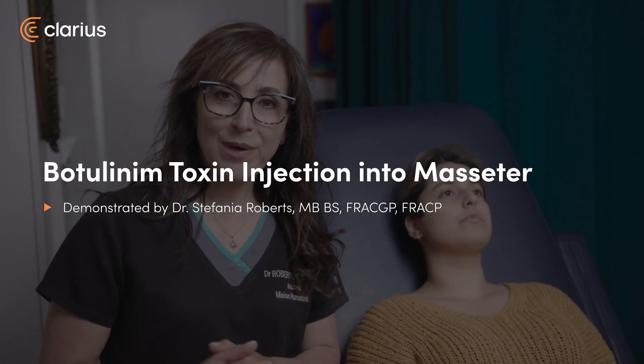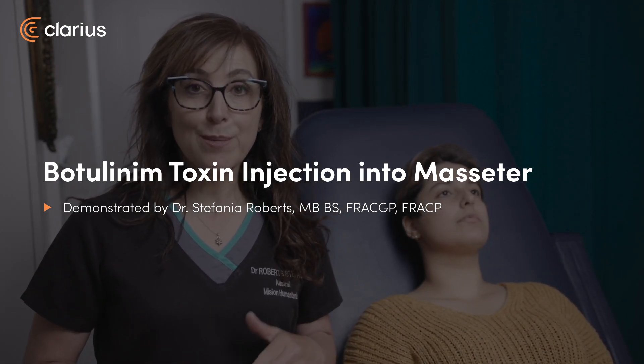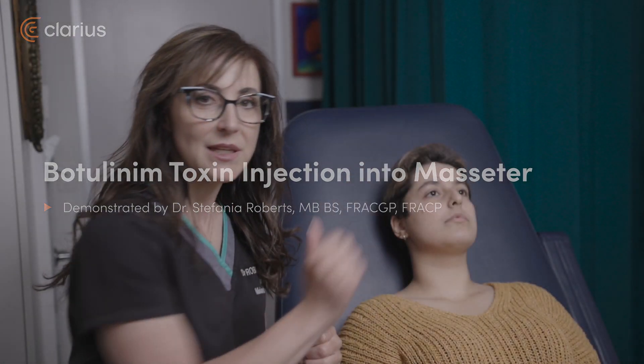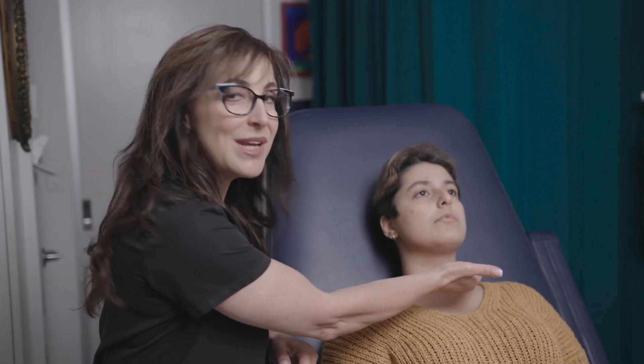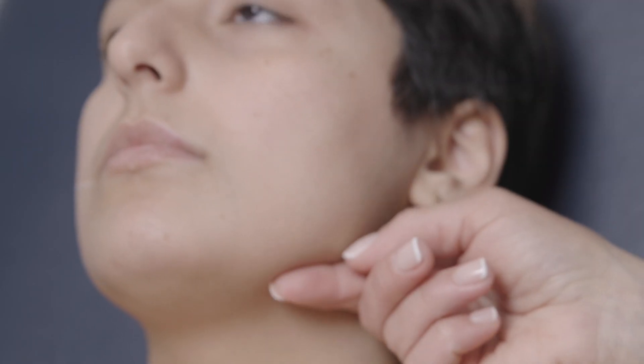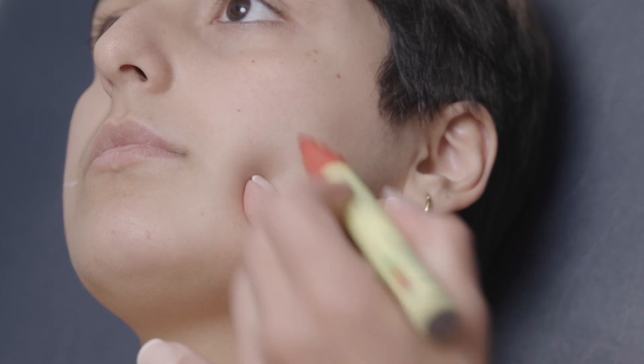We have a 26-year-old patient with masseteric hypertrophy, being larger on the right compared to the left hand side, secondary to grinding. The masseteric hypertrophy contributes to the overall squareness to the lower third of the face. Today we'll be injecting the masseters with botulinum toxin, marking the left masseter.